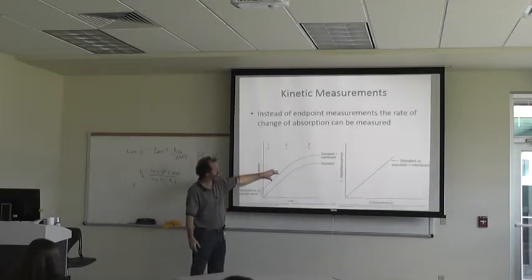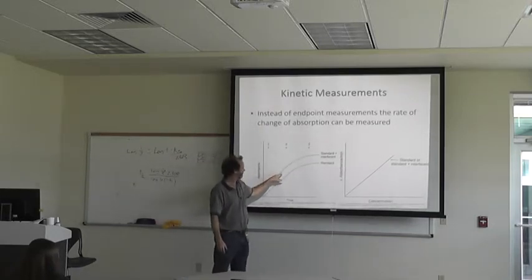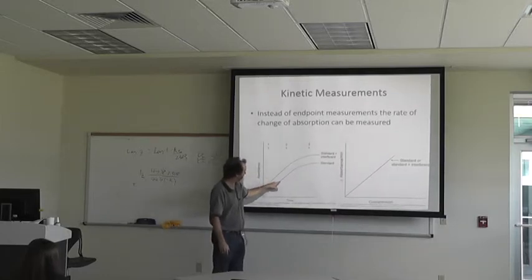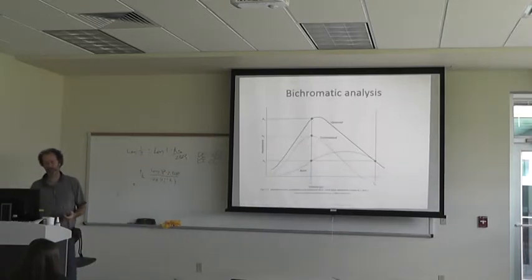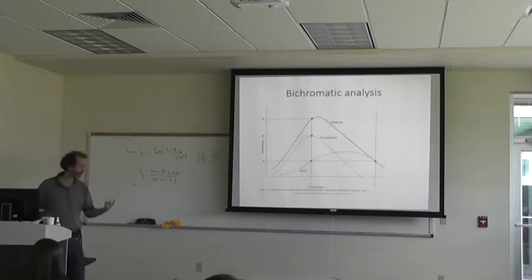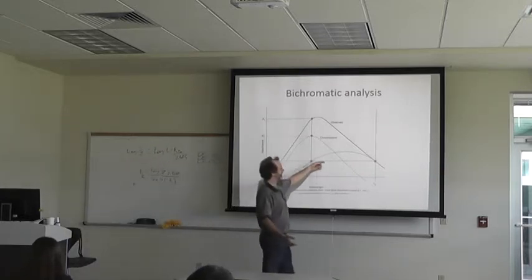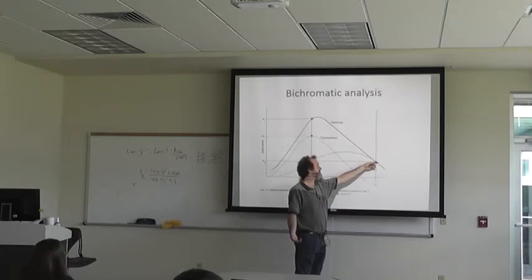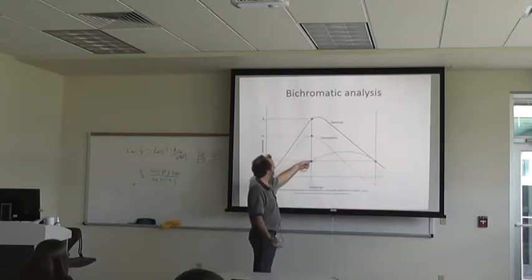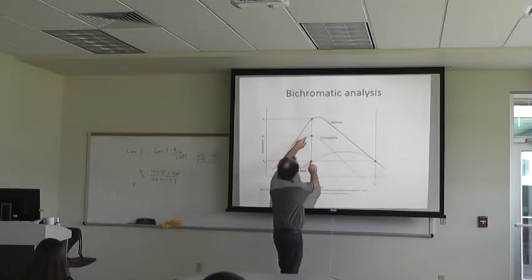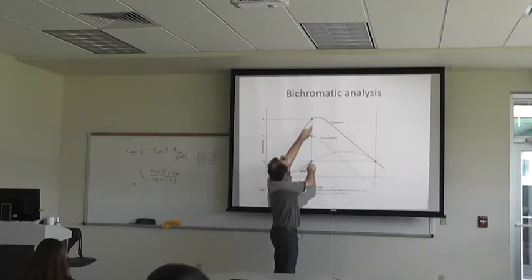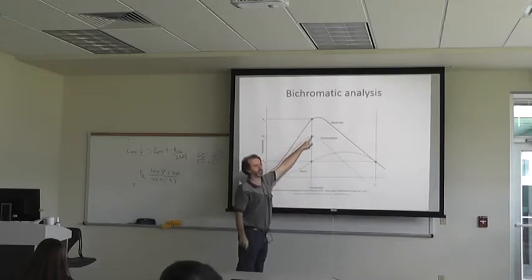If you just look at the change in absorbance over time versus just an endpoint, if you have the endpoint here it's going to be a lot higher than the endpoint there, and that's due to the interference. Have you heard of bichromatic analysis? You measure at two different wavelengths, and basically use one wavelength as the zero-absorbance reference — like a blank — and subtract the absorbance at that wavelength from the observed absorbance to get the real amount.